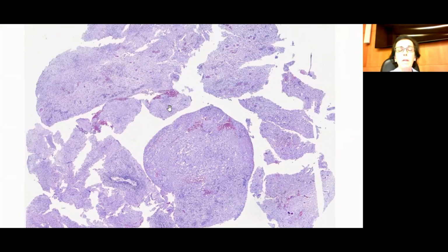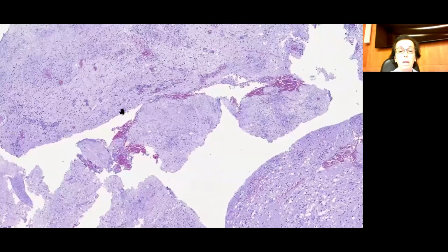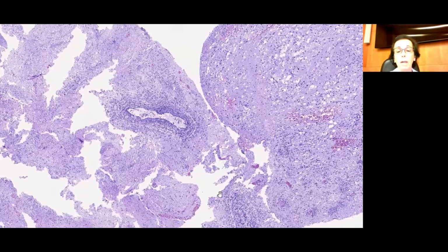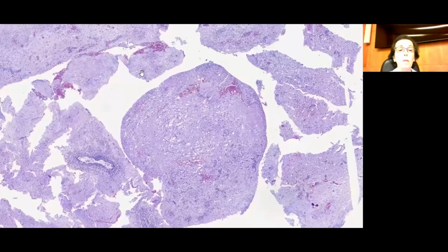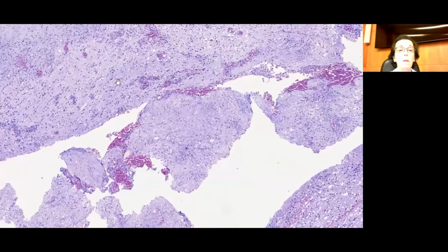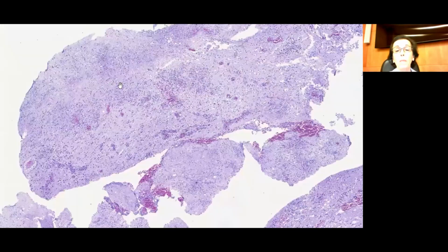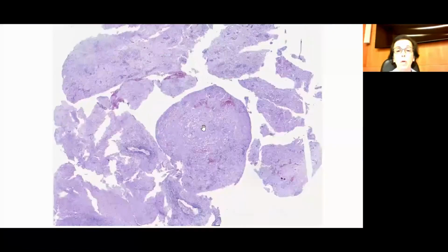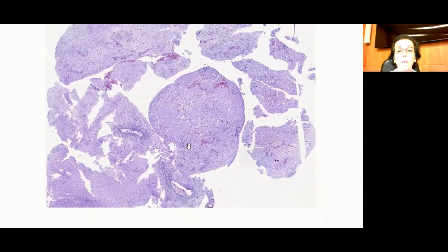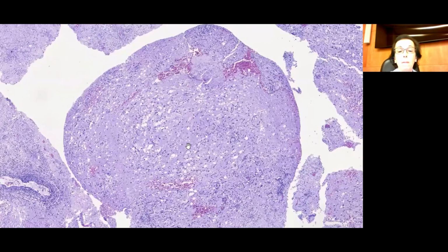I suppose you have seen, this is an inflamed brain here. There are cuffings of lymphocytes here, edema, gliosis, necrosis here, no inflammation, no granuloma. So with this information, I think you know already what we have to look for. We have to look for toxoplasma.